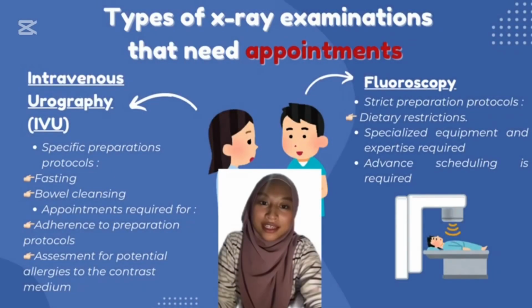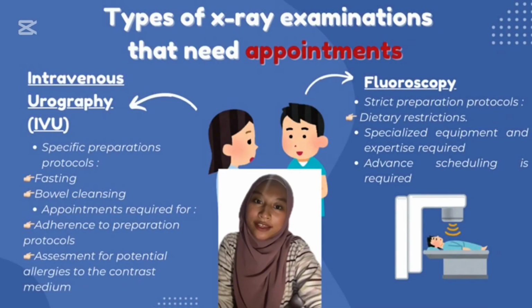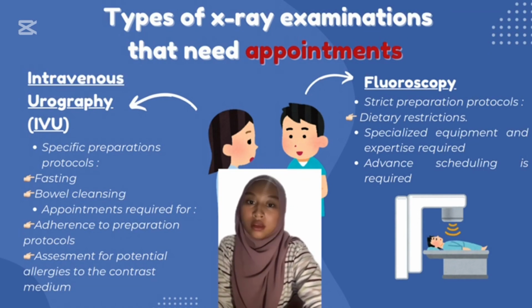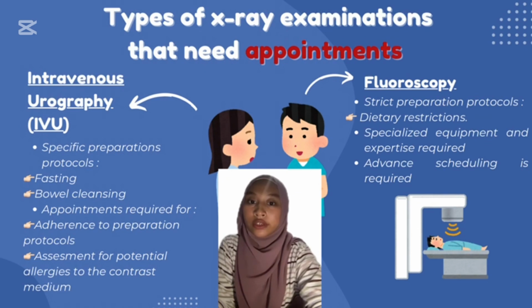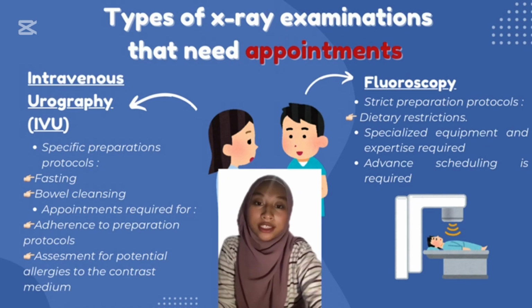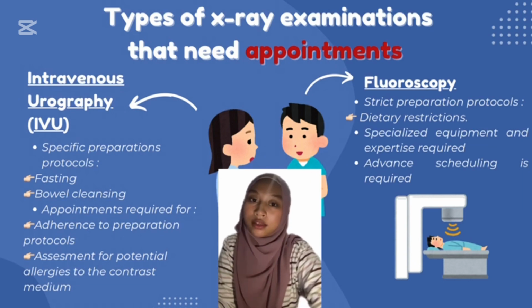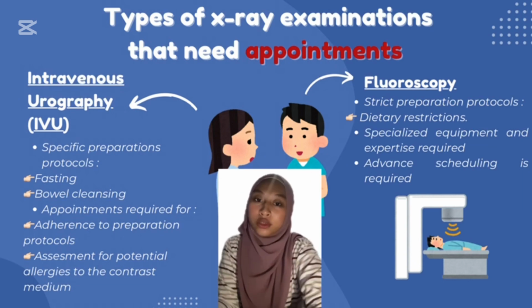Intravenous urography (IVU). IVU is a specialized X-ray procedure used to evaluate the urinary system, including the kidneys, ureters, and bladder. During this procedure, a contrast agent is injected into the bloodstream to enhance the visibility of the urinary tract on X-ray images.